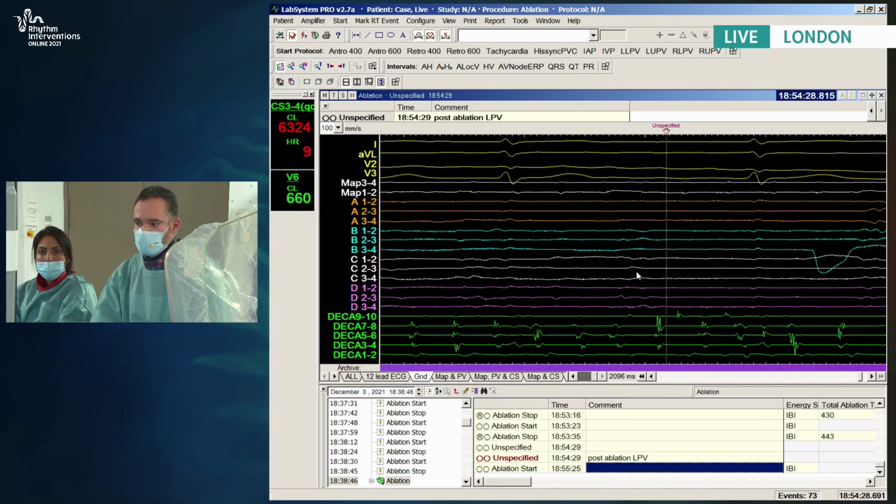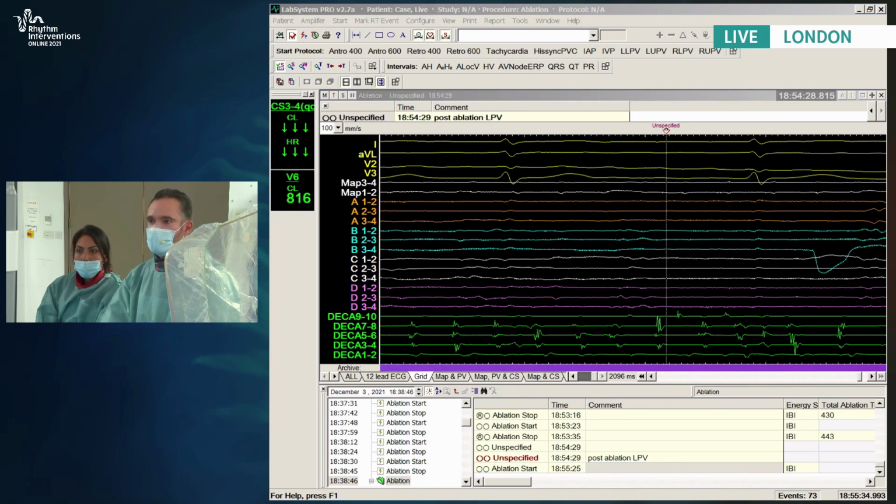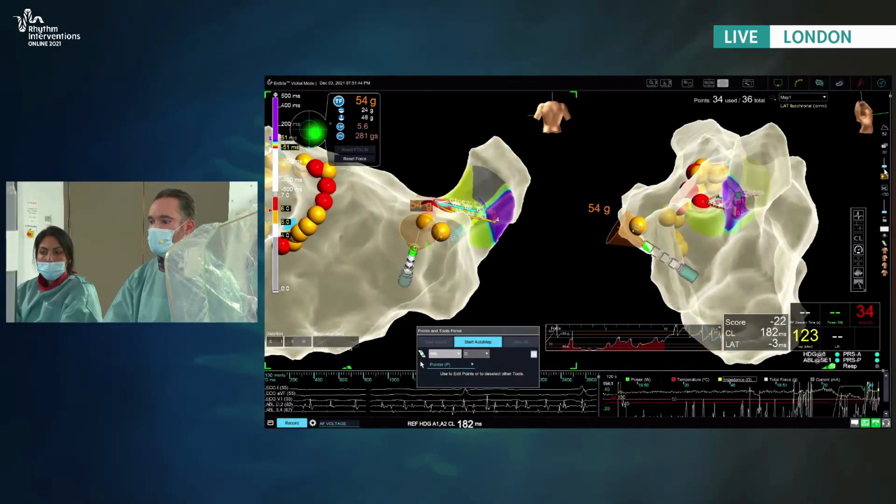Sorry, yeah, there are some very small electrograms there on the pulmonary vein mapping catheter, which again have just disappeared, but I think that must be a deep breath or something. It's too early. Okay, there you go. So I pull back just a little bit. Some fairly fast signals there in the right upper, intermittently, actually.